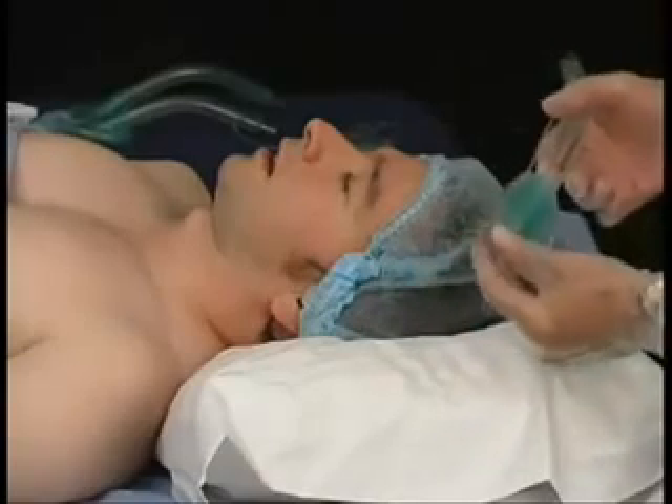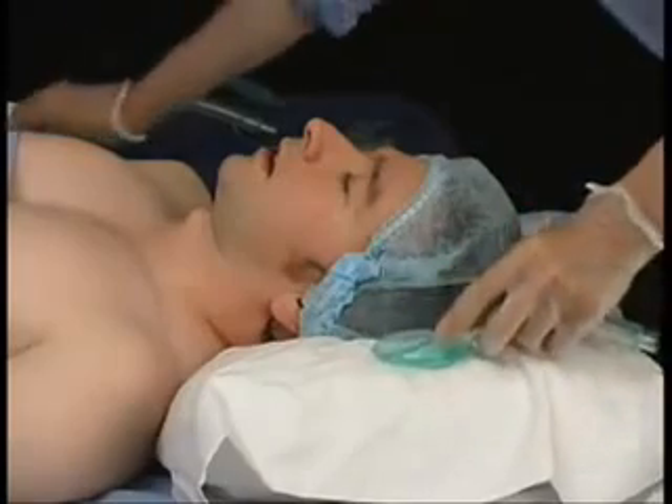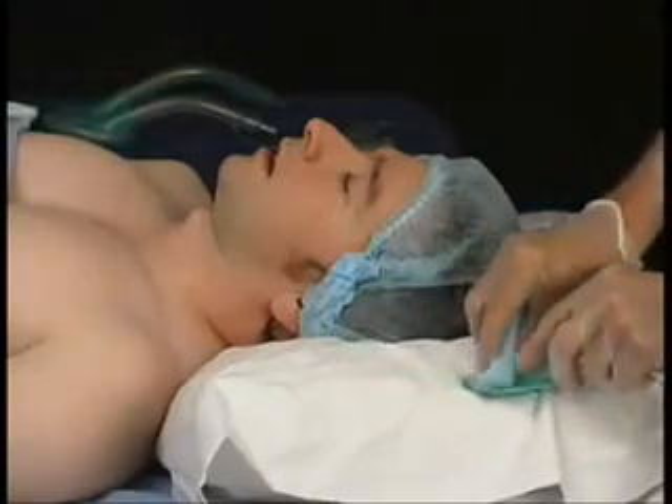Next, prepare the Solus for insertion by putting some gel or lubricant on the back of the cuff. Just on the tip of the back plate is all that is required.